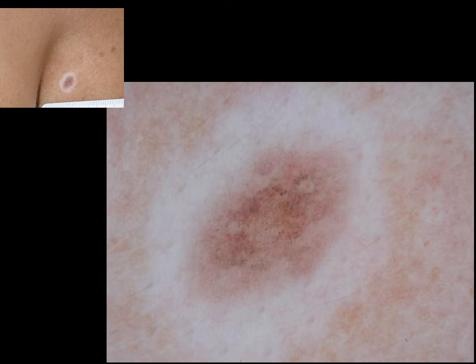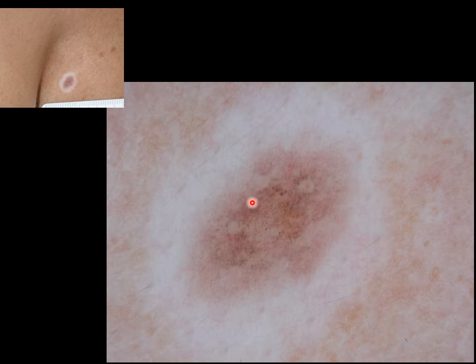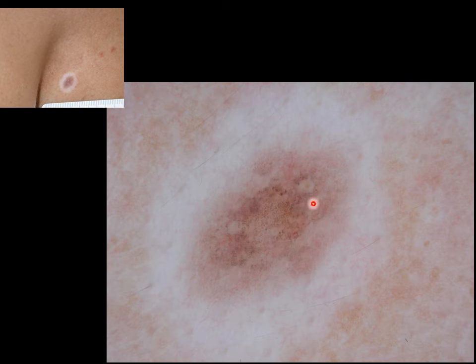Sometimes in halo nevus — here again you see the white halo — you can find signs of regression in the center of the nevus, like this pepper ring.